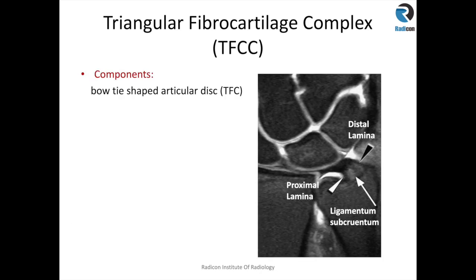Here is an example of a TFC disc, which is a bow tie-shaped structure. It has a proximal lamina which inserts onto the ulnar, and it has a distal lamina which almost inserts onto the ulnar styloid process. In between, this area is called ligamentum subcruentum and it is of slightly intermediate to high signal intensity, so please don't confuse it with a tear.